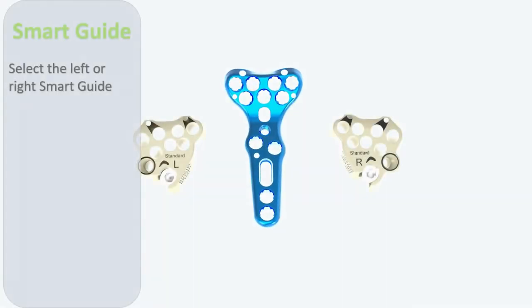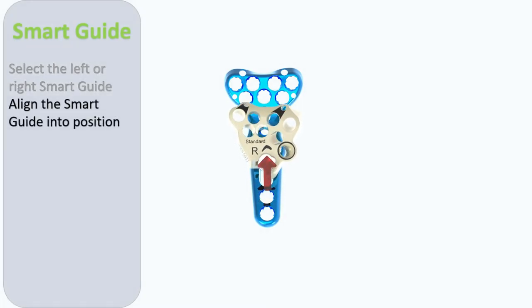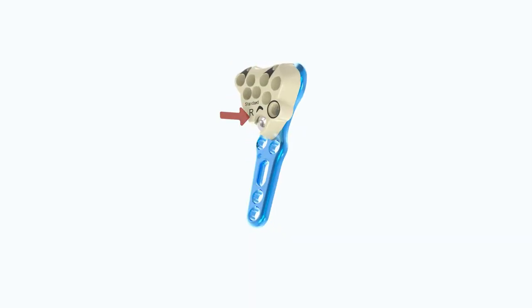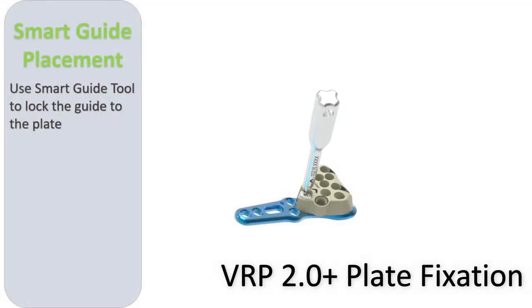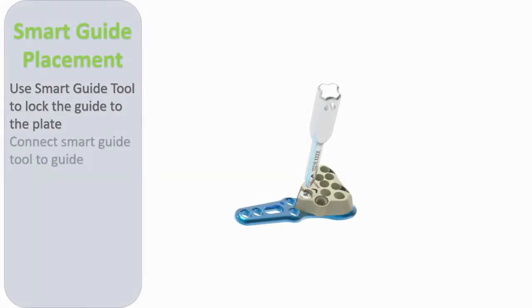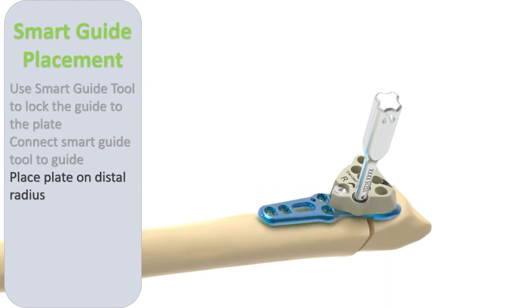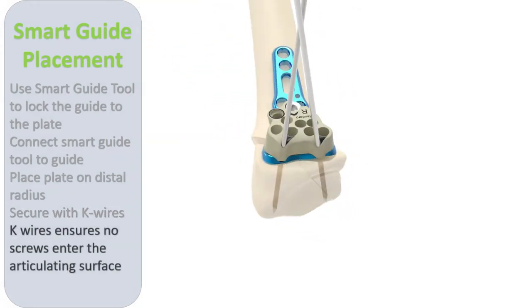The appropriate smart guide for either left or right wrist is chosen and moved into position on the plate. The smart guide tool is then used to lock the guide into position. The smart guide tool is then screwed into the hole in the guide with a circular laser marking, which allows the guide tool to help guide the plate into position on the radius.